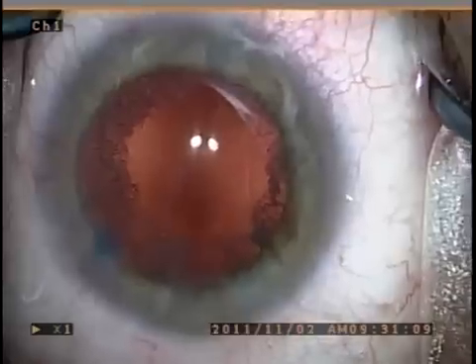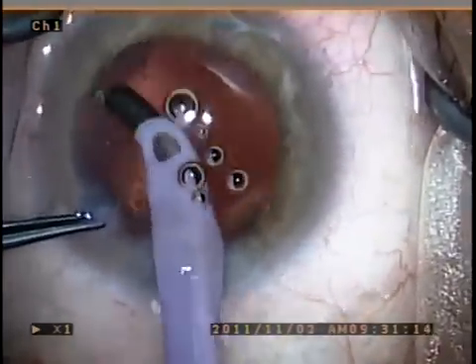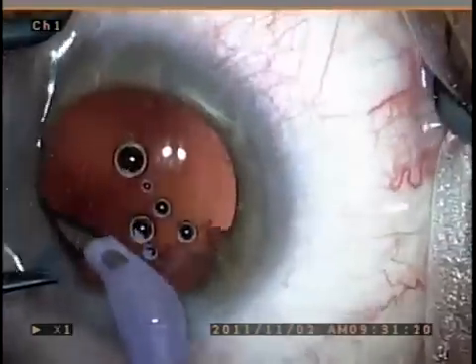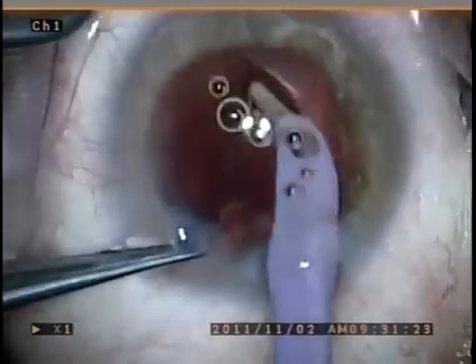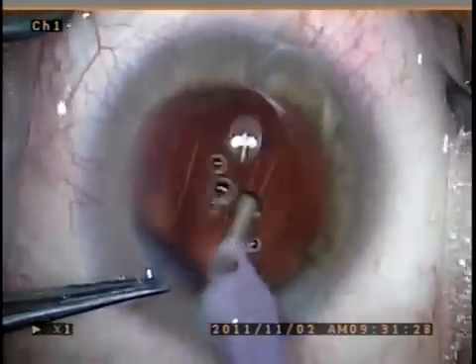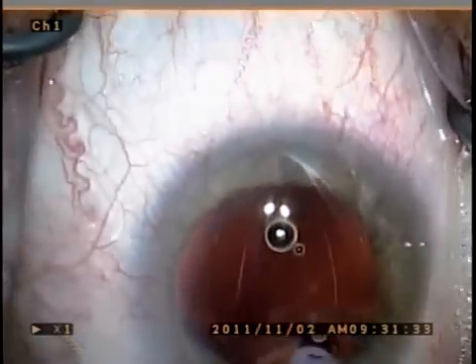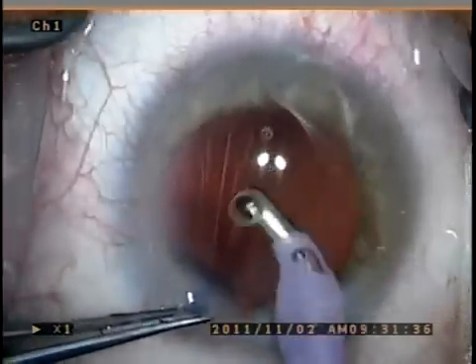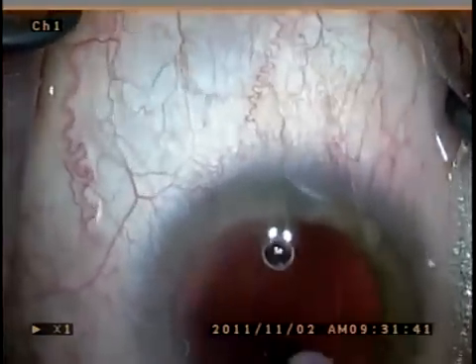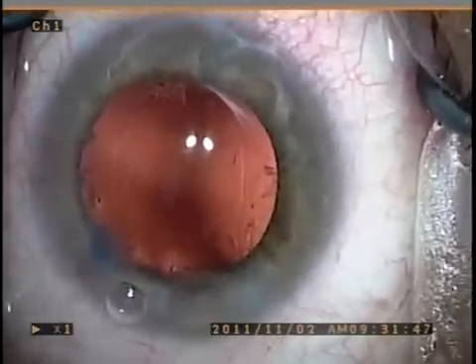As you can see there's very little remaining cortex, basically in the capsular bag fornices, and that is removed with a curved IA tip. I find the curved IA tip very helpful, especially for sub-incisional cortex, and it makes my job a lot easier.